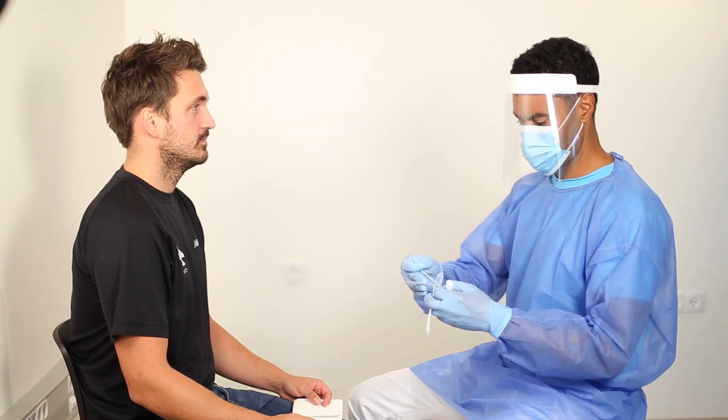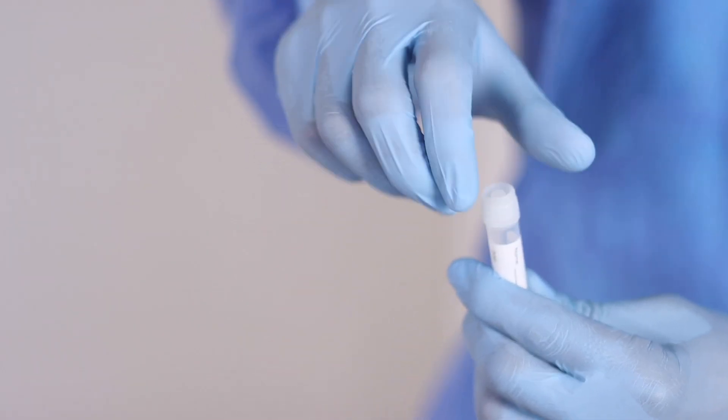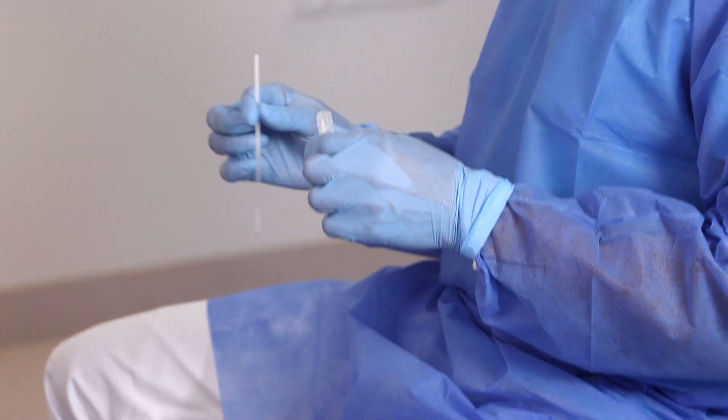Remove the swab from the packaging. Open the lid so the swab with the specimen can easily be submerged in viral transport medium.